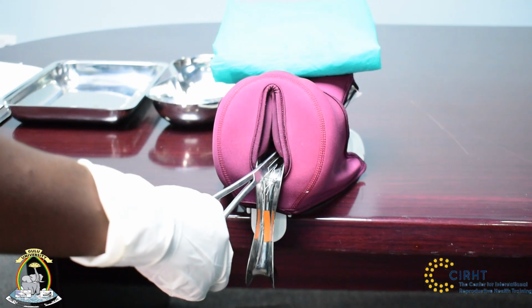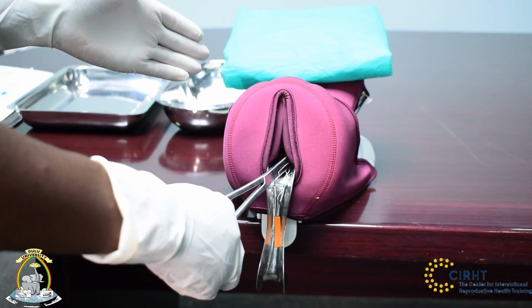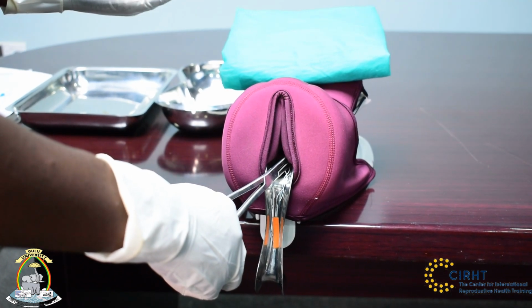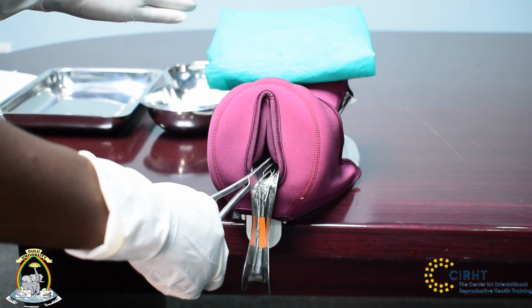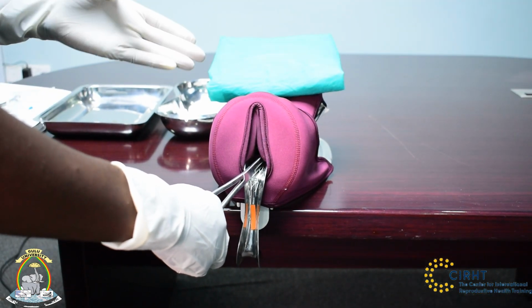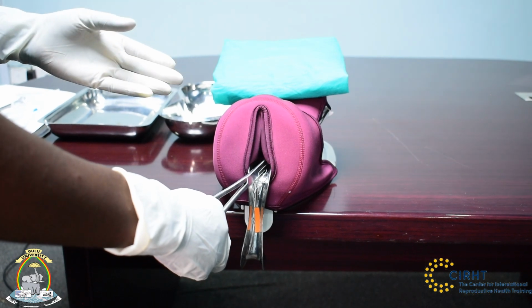And then at this point, we now want to make sure we progress. But remember, we said when we feel resistance, it shows that we've reached the back wall of the lower segment of the uterus. So still here we are keeping our forceps, which is holding the copper T, closed so that we don't lose the IUD before we reach the fundus.